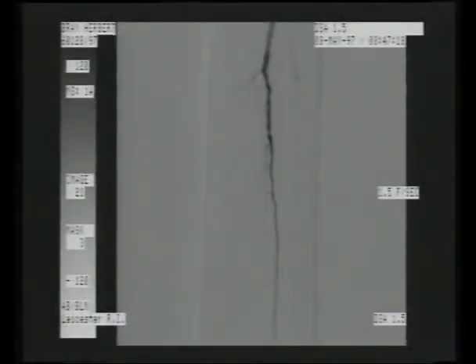The arteriogram confirms that there is one runoff vessel, which is through the peroneal artery. There is a small stump of the anterior tibial artery and at the foot level, a small anterior tibial artery is present. Therefore, we are going to recanalize the full length of the anterior tibial artery.